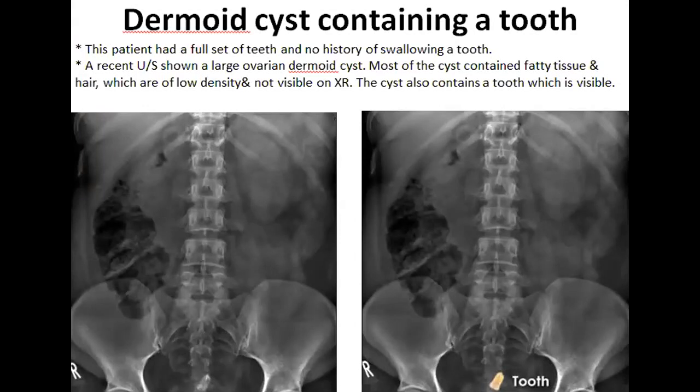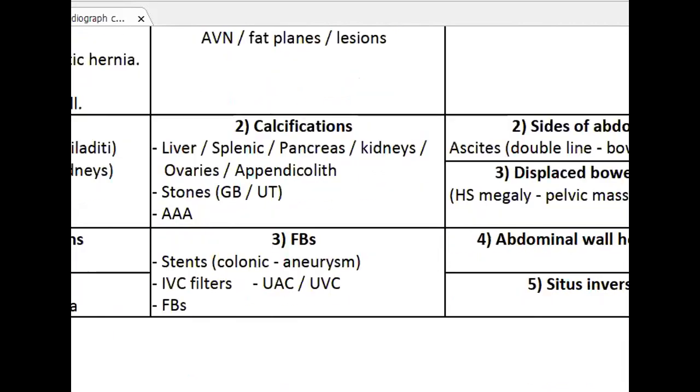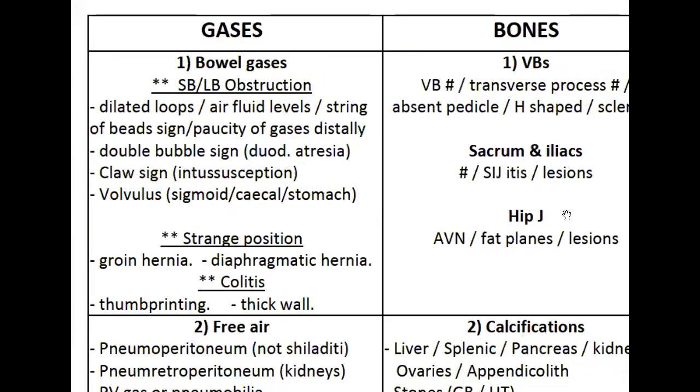So now it is time to show you the checklist. When you are commenting on the rapid reporting, you should check for this in your mind.